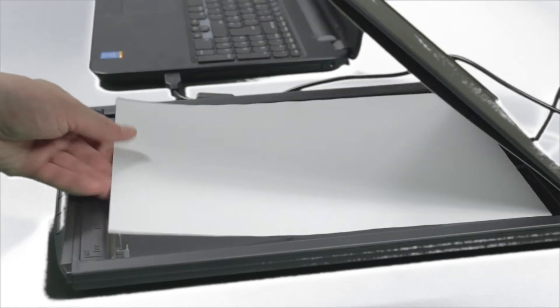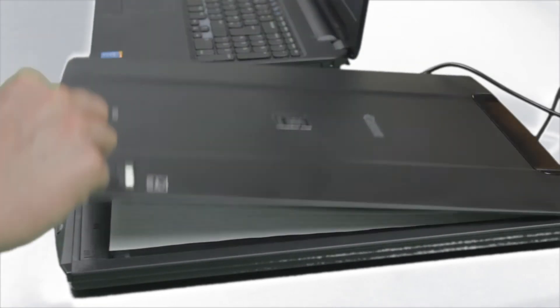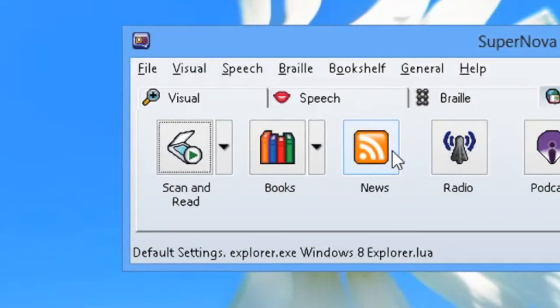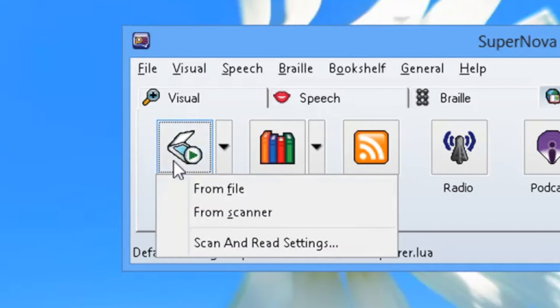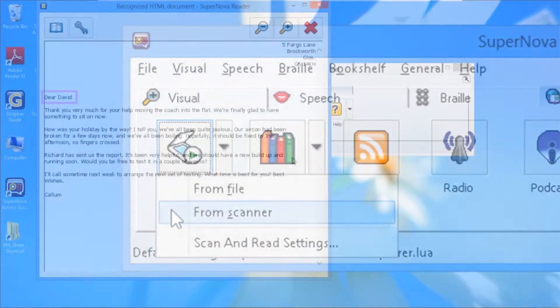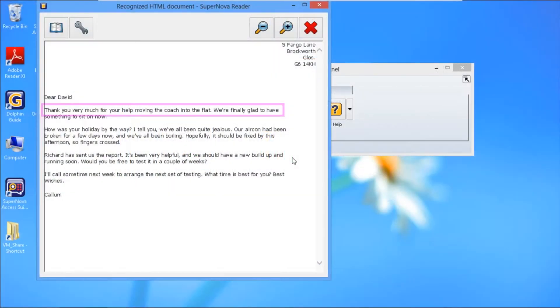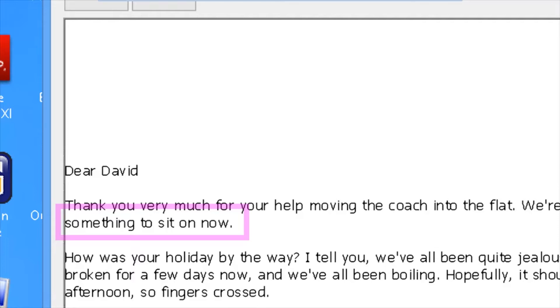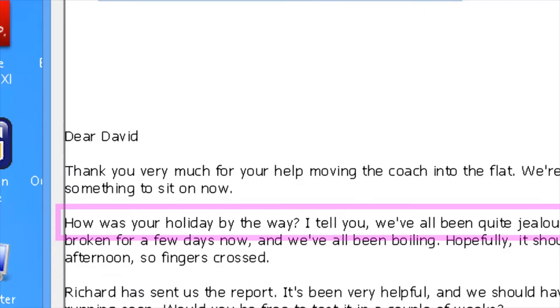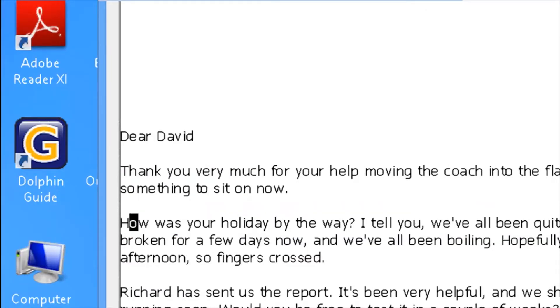Print documents and inaccessible PDFs can be read with Supernova. Read text independently with magnification, speech and braille.